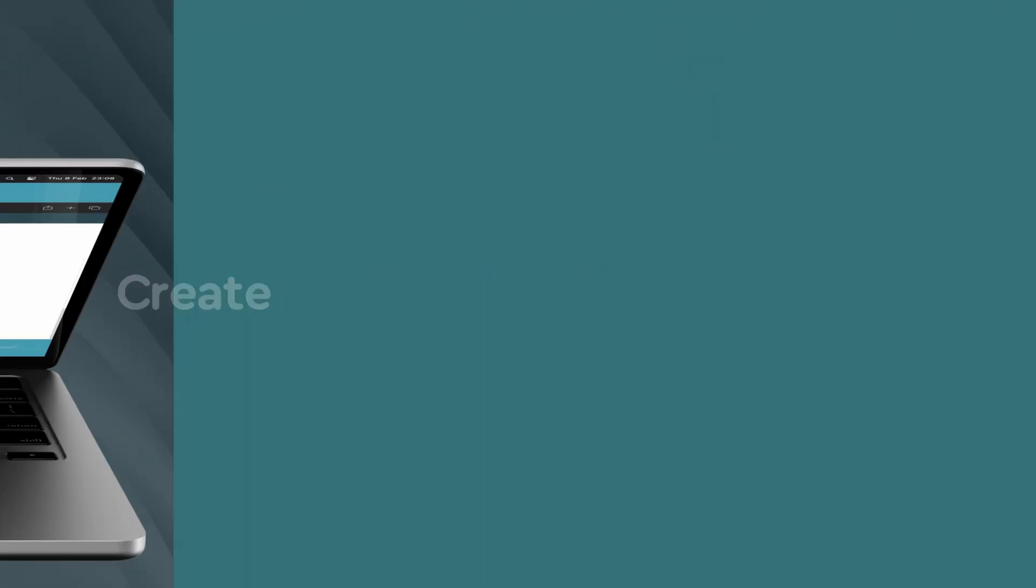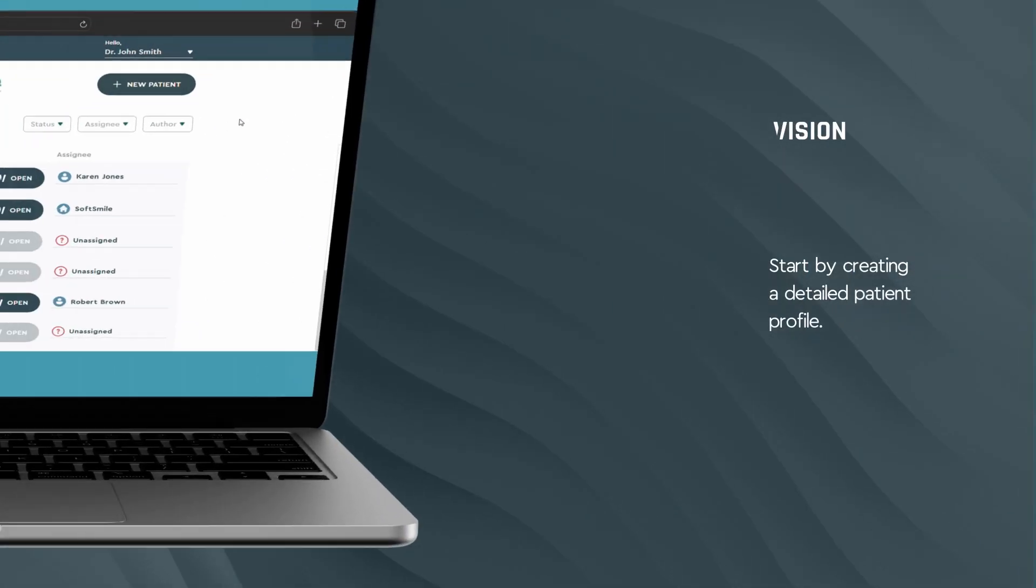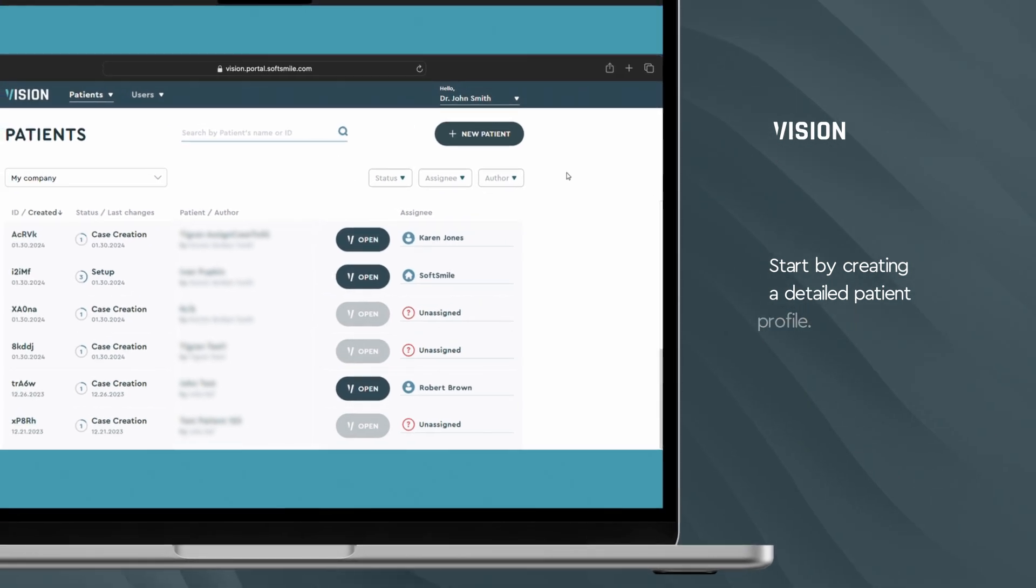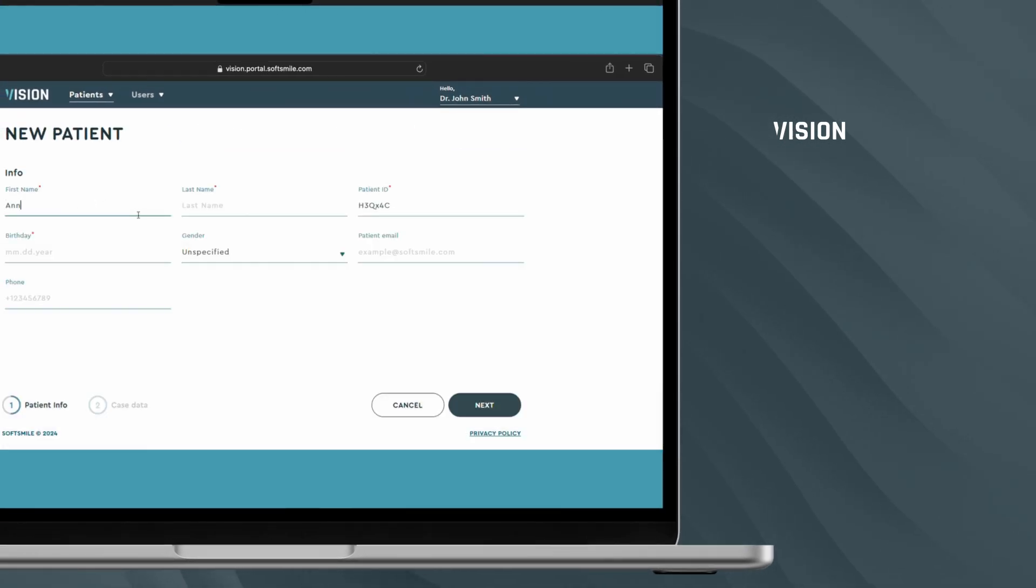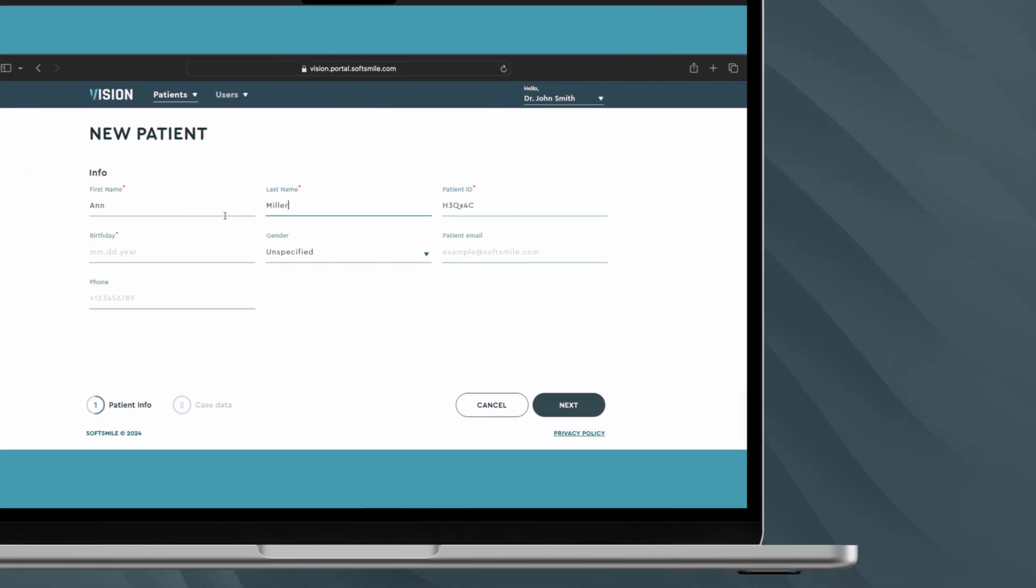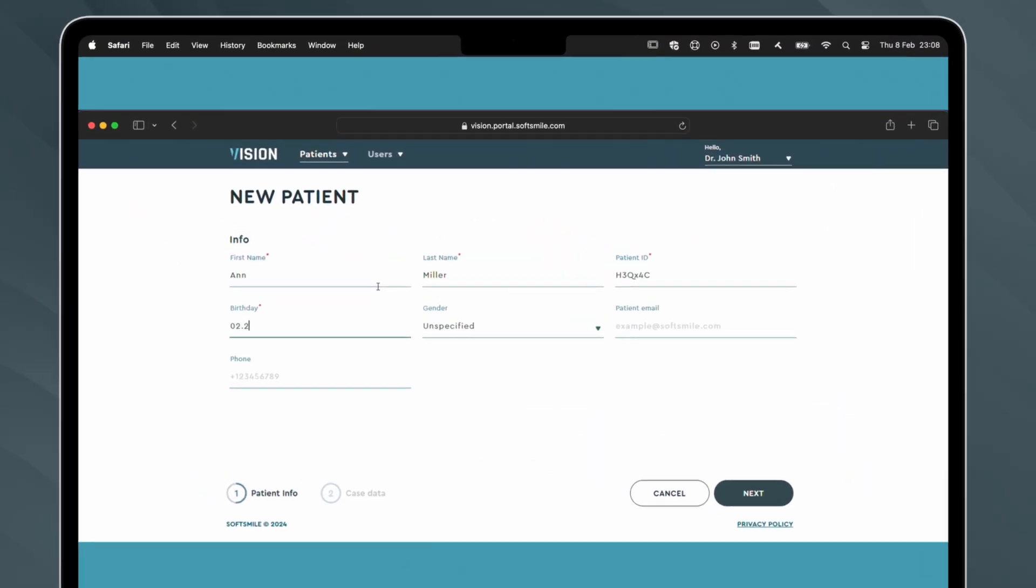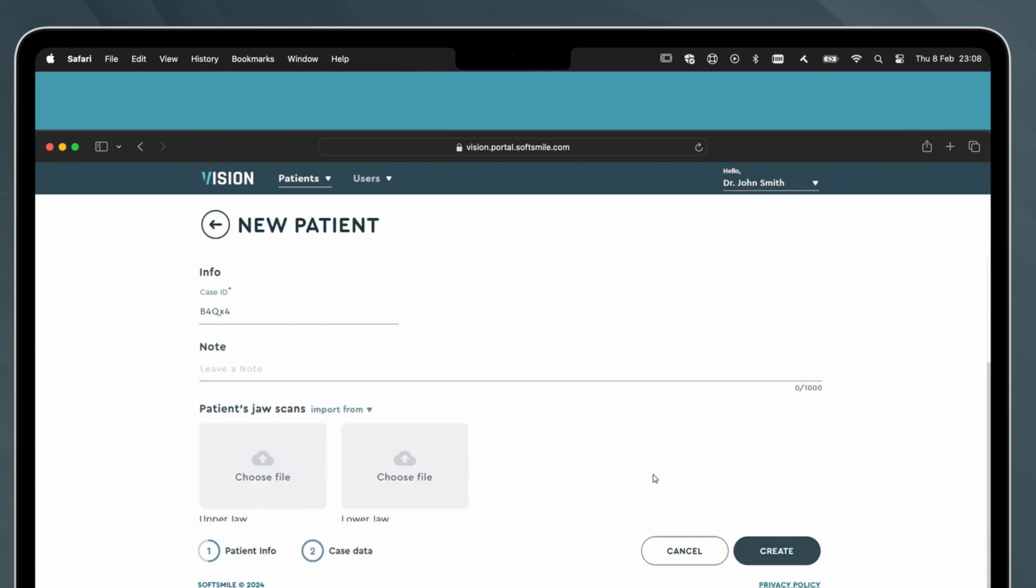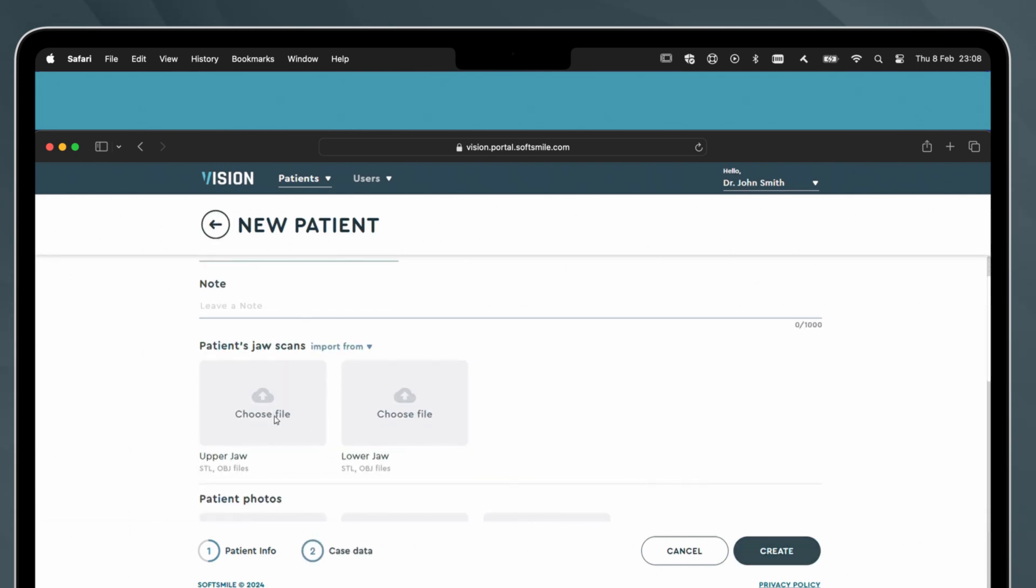Here's how. First, create a patient profile. This profile is the cornerstone of personalized care, tailoring our services to meet your patient's unique needs.